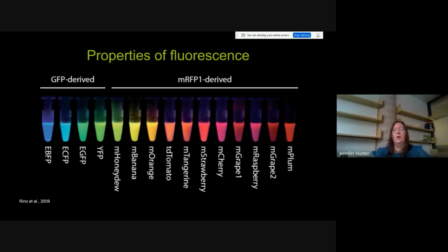So for example, here we think of a common fluorescence property as being spectral properties, but the challenge is, when I showed you those spectra, NADH is very similar to the retinoids, and the retinoids each have, even though they have different properties, very, very similar spectra. And so separating spectrally can become very difficult within the retina because of the overlap.